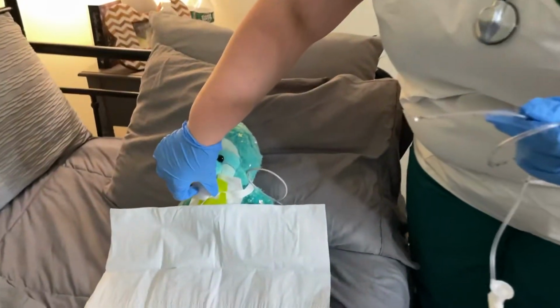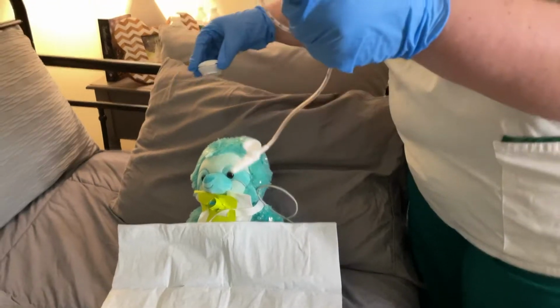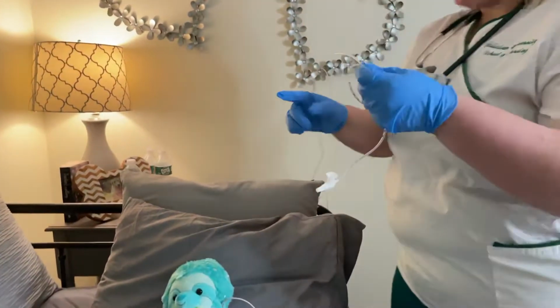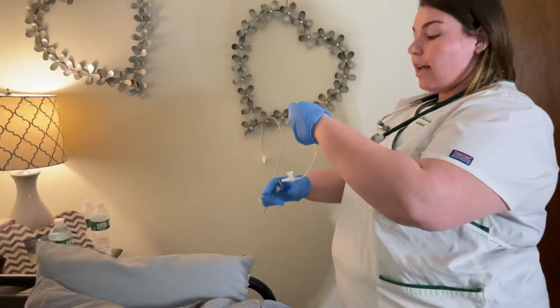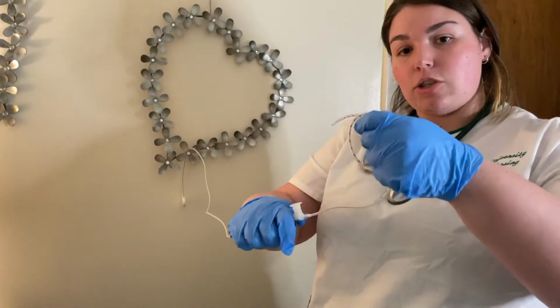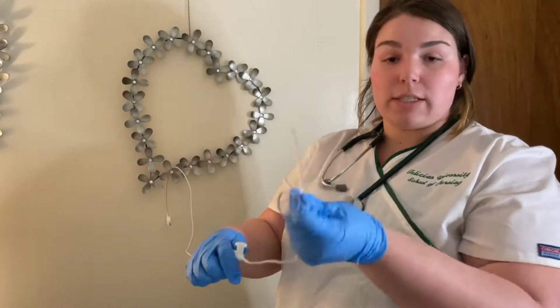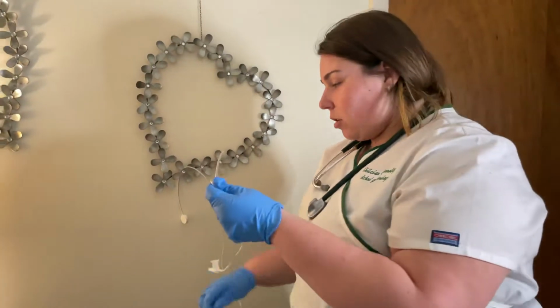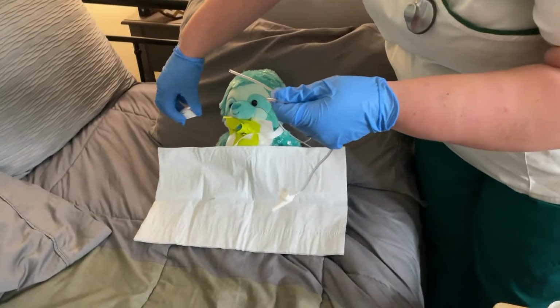I'm going to remove the oxygen from the patient. Before I remove the oxygen, I'm going to take my suction tubing and attach it to the white portion of my suction tubing. So now this white becomes non-sterile. You want to make sure that it doesn't hit anything or come close to the sterile portion of your tubing. So now that that's attached, we can remove the oxygen.